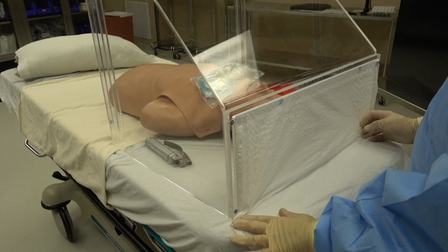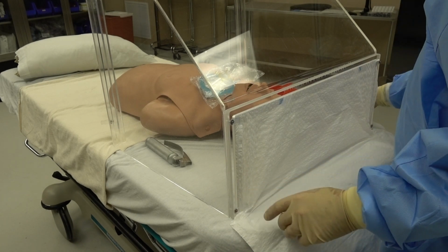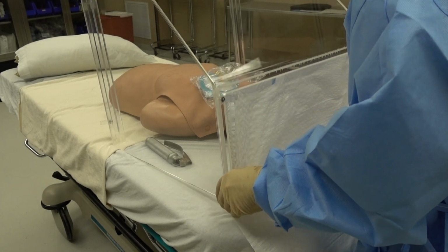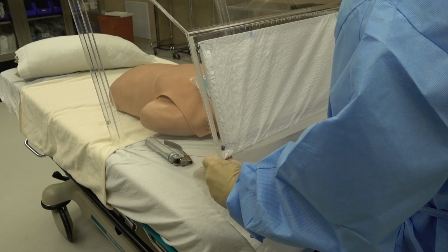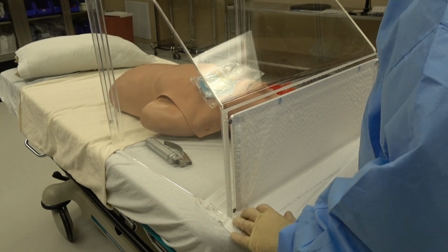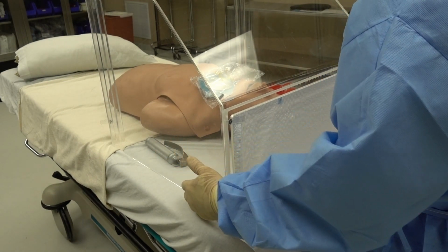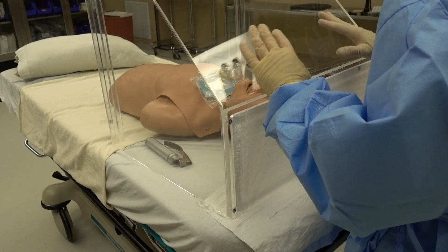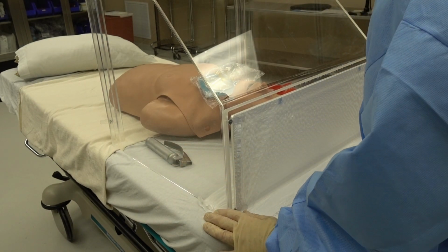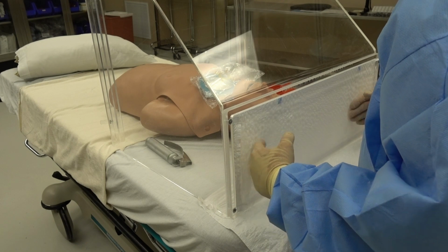And that's all there is to installing it. And again, if you pick it up and place it where there's pressure on it from the containment chamber, that'll help keep it tight. And you can place the whole thing in there if you want, the bag. I usually do place it under the patient's head, and that helps keep the bedding clean also. Now, this is airtight.